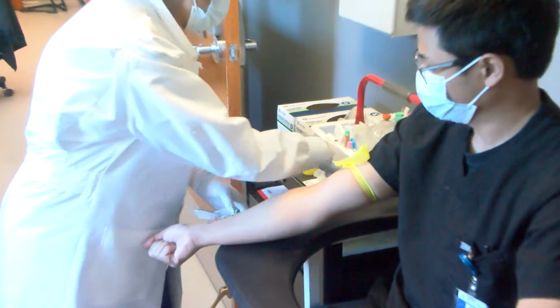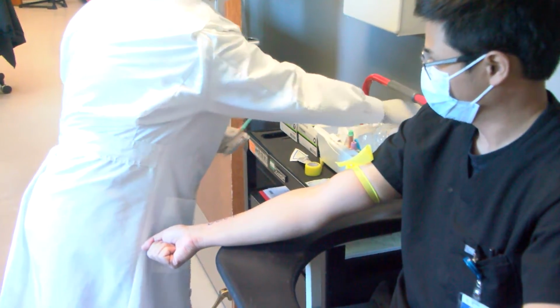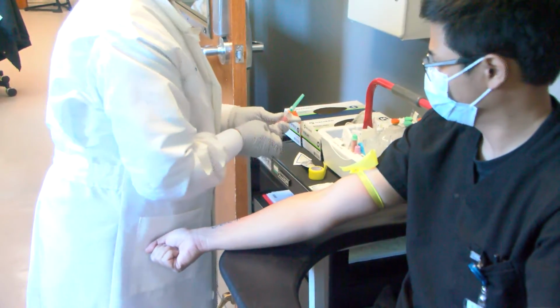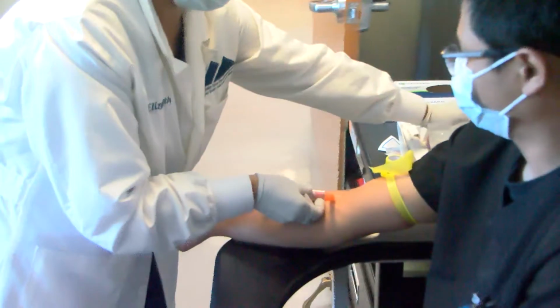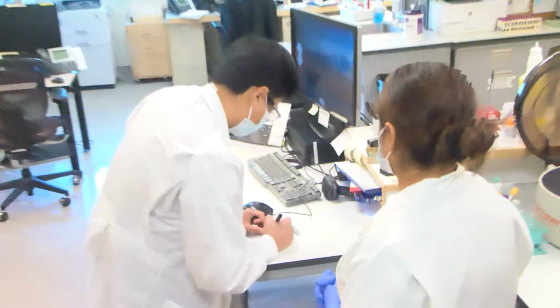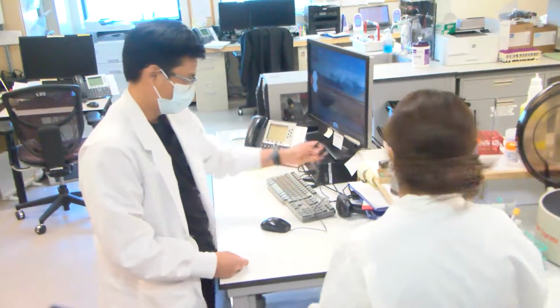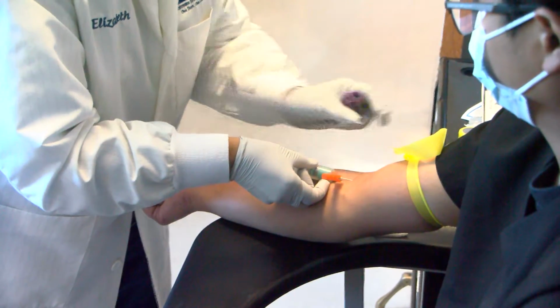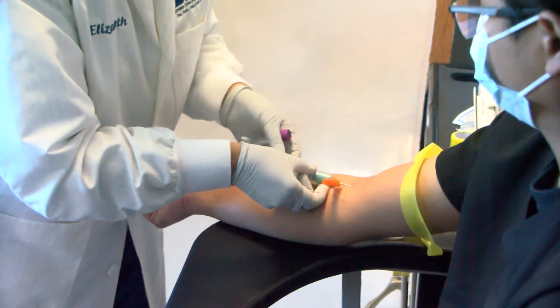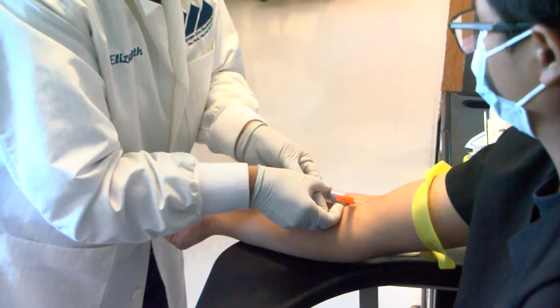This is Elizabeth. She's been a phlebotomist for Northern Inyo Hospital for 8 years. Right now she's drawing our patient's blood. We use different colored tubes in the lab for different tests. They all have their special function. All of our phlebotomists have to have special training, and they actually have a license through the state of California to draw blood. The different colors of tubes have different additives in them.